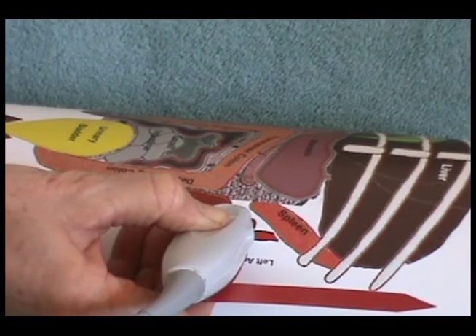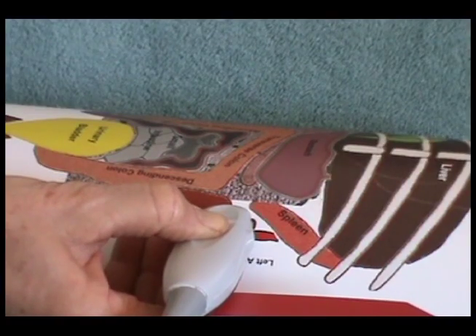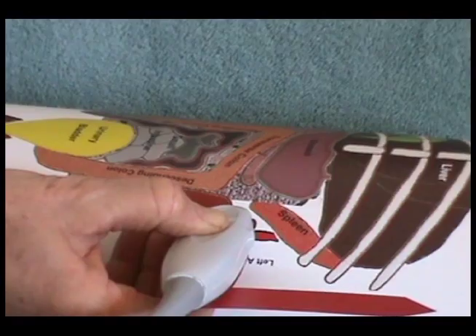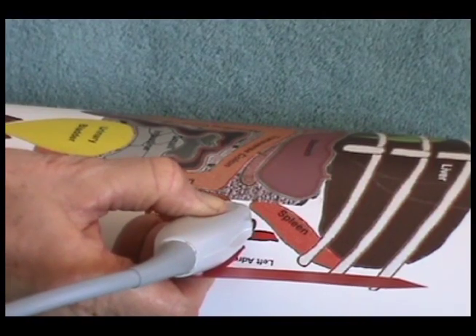Fan the transducer very slowly, ventrally or dorsally till the aorta and the left adrenal are seen.